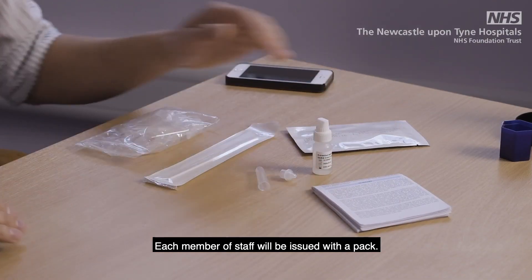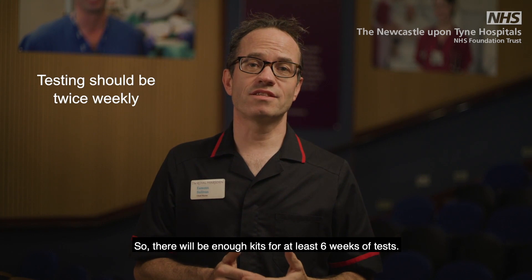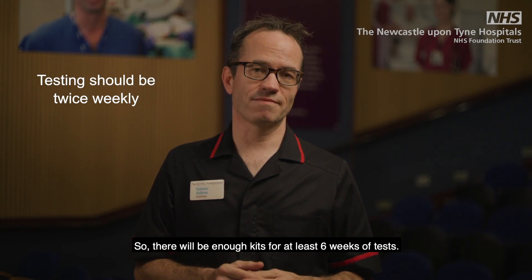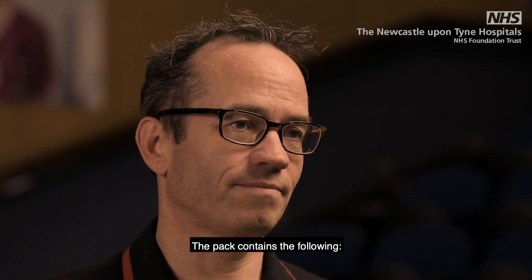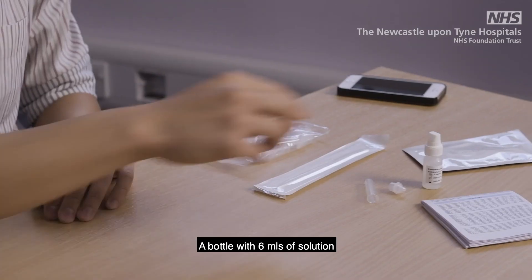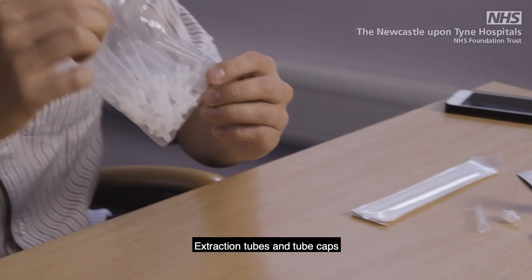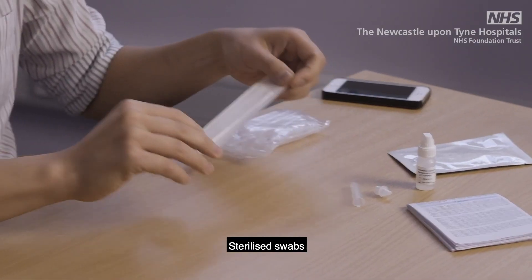Each member of staff will be issued with a pack. Testing should be done twice weekly, so you'll have enough kits for at least six weeks of tests. The pack contains the following: an instruction leaflet, foil pouches containing the test cartridge, a bottle with six mils of solution, extraction tubes and tube caps, and sterilised swabs.